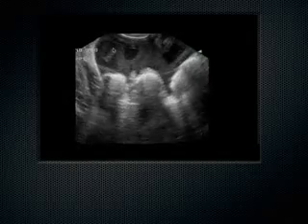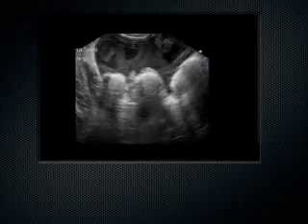So we go ahead and do an endovaginal ultrasound. You can see right over here there's blood actively bleeding, extravasating, if you will, from this region of her pelvis. And this is all blood here. All this other stuff is blood here in her pelvis. We put it together that this is a ruptured ectopic pregnancy, and we call OBGYN. And before we even have a pregnancy test back, she's whisked off to the OR, and she survived.